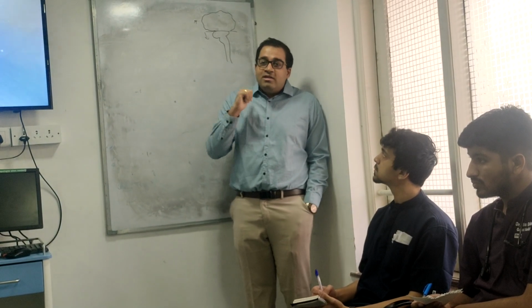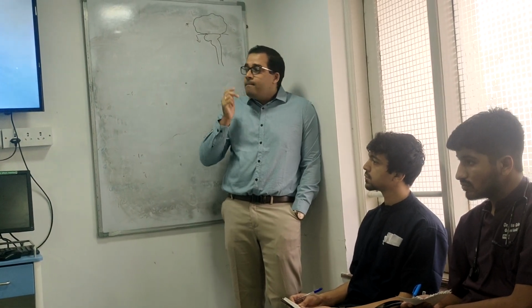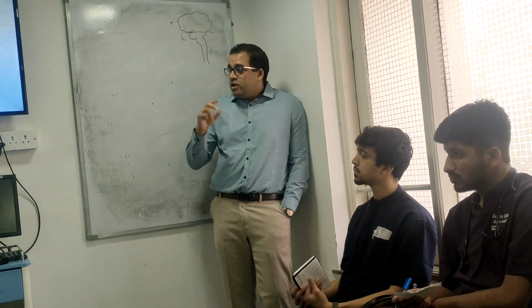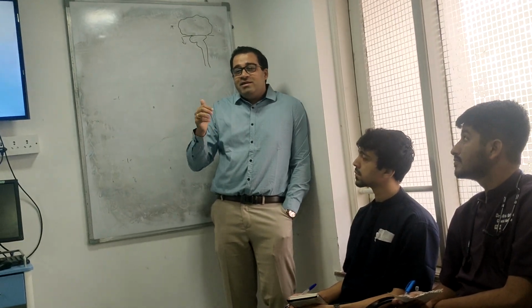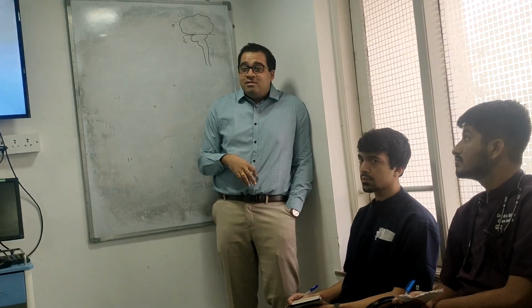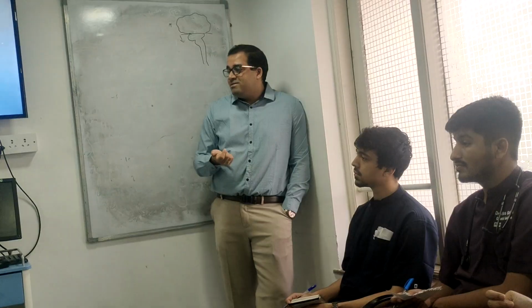Randomly at 10 at night a call comes with a GNB flag. What is this about? Something has grown. So it will grow inside. How does a technician know at 10:05 p.m. that there is a growth in the machine? Automatically. How does the machine know that there are bacteria inside?